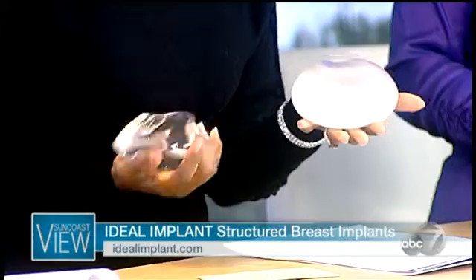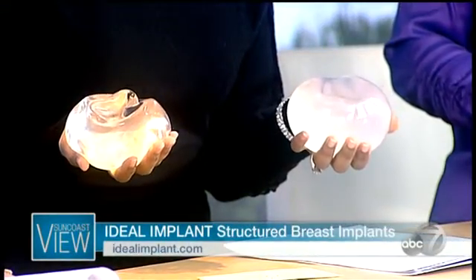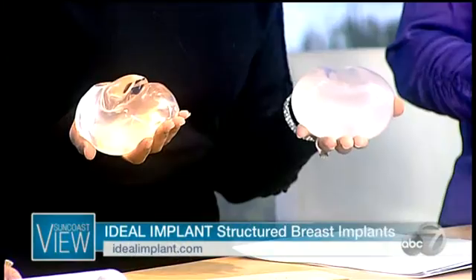But the edging also controls the movement, so you don't have all of that bouncing and all of those things that we've seen associated with heavier implants. So it really sits on the breast well. It's also round, which I thought was interesting because it prevents any kind of rotating, unlike the teardrops that we saw for so long. The round just falls right back into place, and they've created these really nice edges on it too.